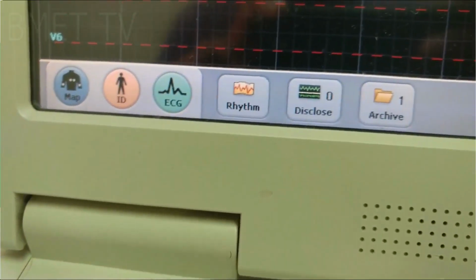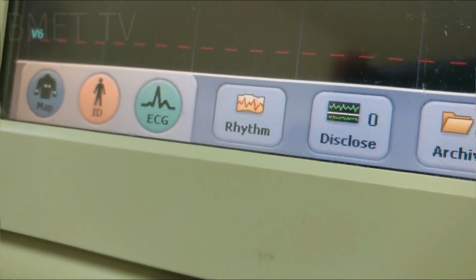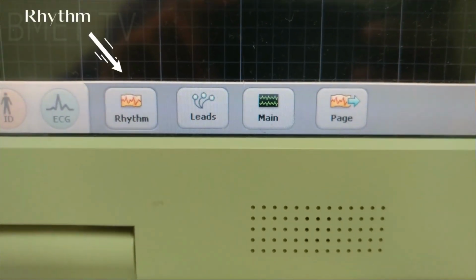What is rhythm in ECG machines? Rhythm refers to the type of heartbeat. Normally, the heart beats in a sinus rhythm with each electrical impulse generated by the SA node, resulting in a ventricular contraction or heartbeat. There are a variety of abnormal electrical rhythms, some are normal variants, and some are potentially dangerous. Some electrical rhythms do not generate a heartbeat and are the cause of sudden death. Rhythm can be recorded for a specific time like 1 to 4 minutes for analyzing PVC.